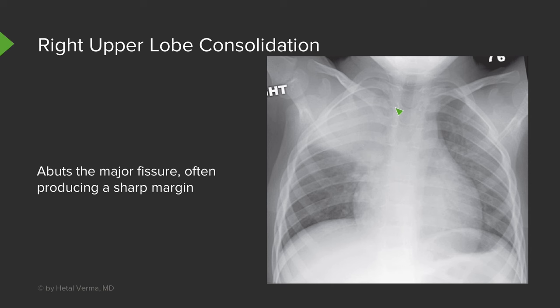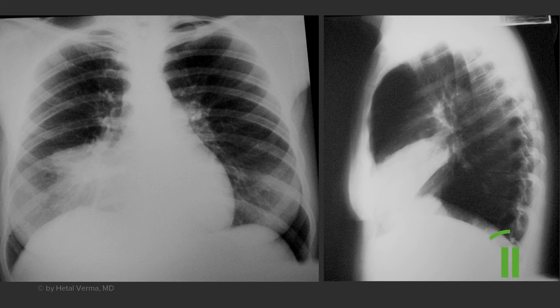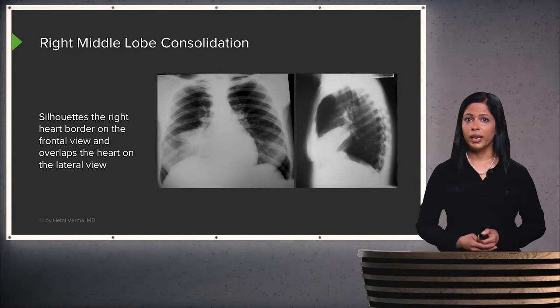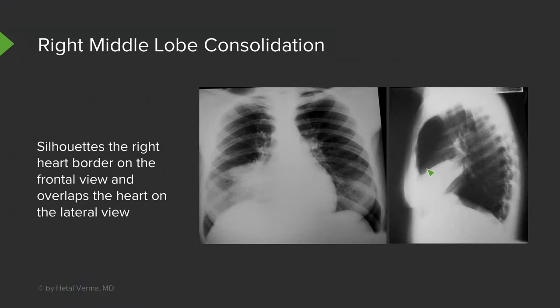This consolidation silhouettes the mediastinum on the right. On the frontal and lateral views, this is an example of right middle lobe consolidation. On the frontal view, the right heart border is silhouetted so we no longer see it. On the lateral view, a middle lobe consolidation overlaps the heart, making it appear brighter than normal — because the consolidation is located adjacent to the heart anteriorly. This is very typical of a right middle lobe consolidation.